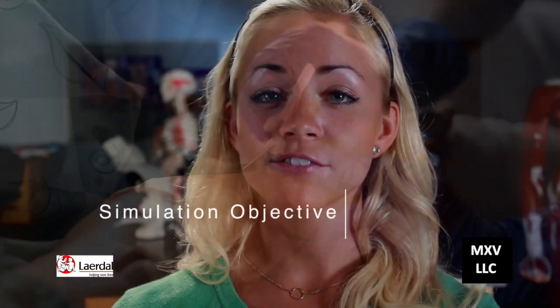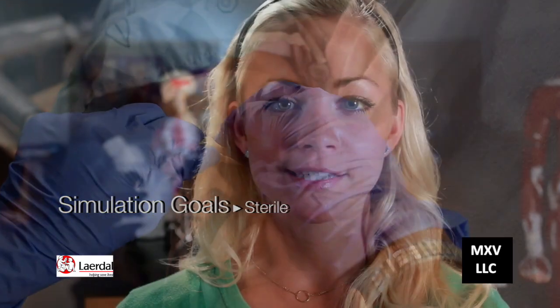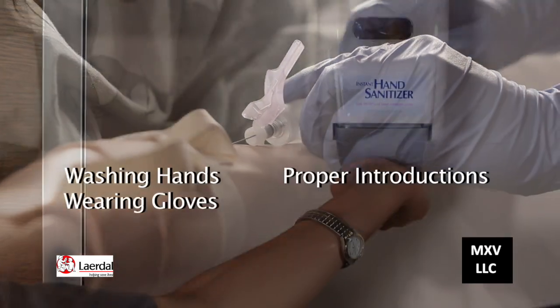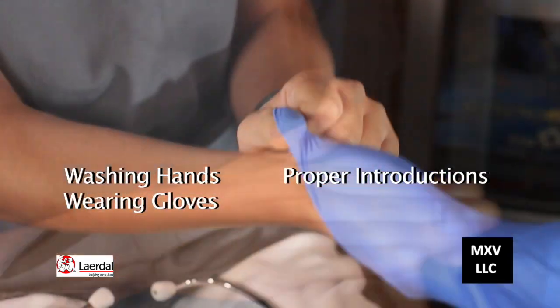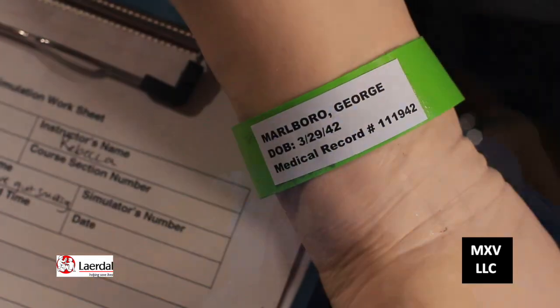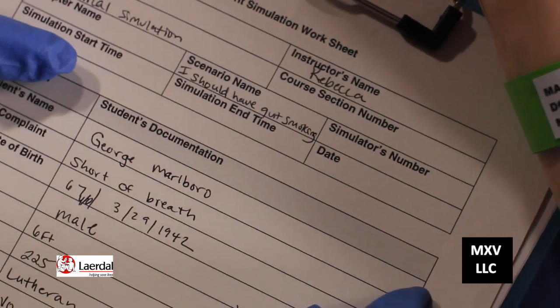The objective for this simulation is to perform a venipuncture, and your goal should include performing a sterile phlebotomy. Along with the essential clinical skills, your instructors will be looking for washing your hands, wearing your gloves, and demonstrating a proper introduction to your patient, including checking the patient name and birthday on the ID bracelet with that on the medical records.